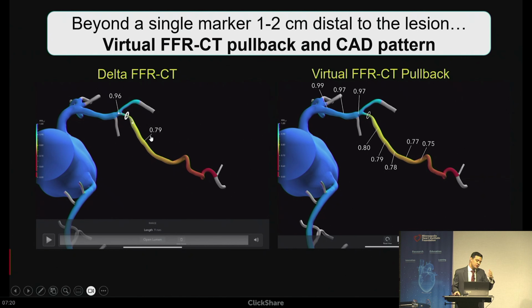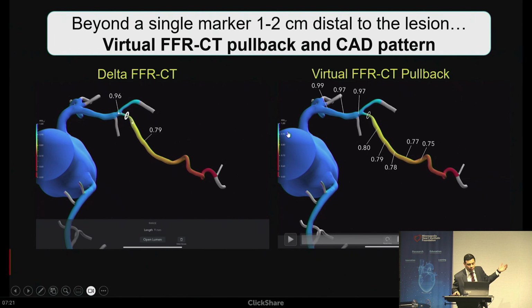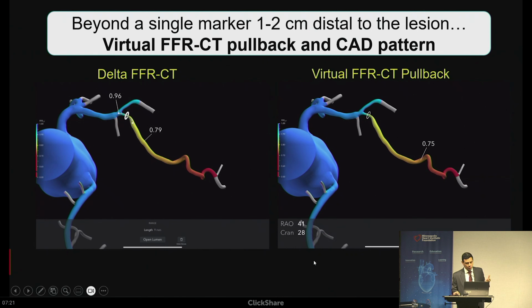The recommendation would be 1 or 2 centimeters distal to the lesion. Is it abnormal or not? But we've learned, particularly now, in the cath lab, not our colleagues, the readers that look at this all the time, but we've learned how we can incorporate this now to literally address what we were talking about just a few slides ago. How to address the phenotype of coronary artery disease, particularly on the right, by doing virtual pressure pullbacks to understand whether the lesion is diffuse or focal. So this is now Physiology 2.0, in which you incorporate non-invasive tools into the cath lab to also have discussions with your patients about the expectations of what you might or might not achieve with your procedure.